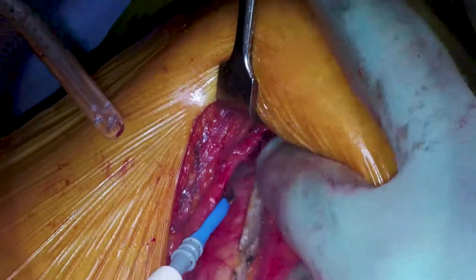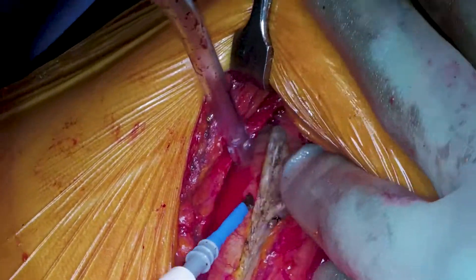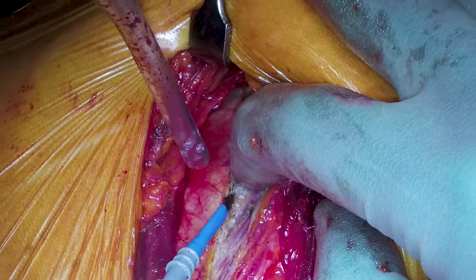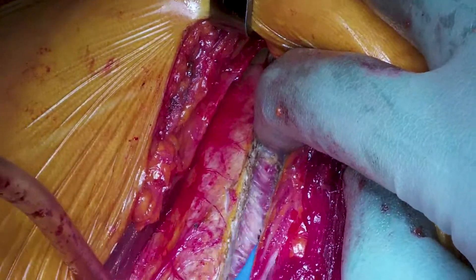Mr. Dunning is extending the incision all the way back to get as much space as possible for retracting the ribs when retractors are inserted. You can see a nice view of the difference in fiber angles between the external intercostal muscles and the internal intercostal muscles right there.